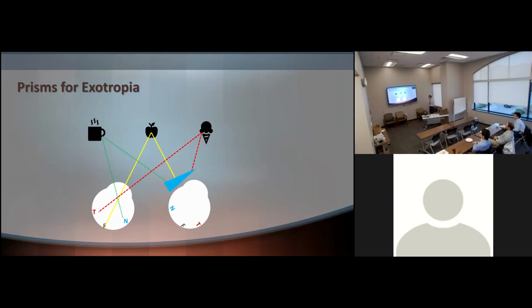Okay, then we have the prism base in the same concept. We're going to redirect all the light beams. So our new fovea now will be looking at the apple. So we have single vision. Here, I know it's confusing, but I think this animation makes it slightly understandable. Okay, in real life we test this by Worth dot test, right? And with Maddox with neuroophthalmology.